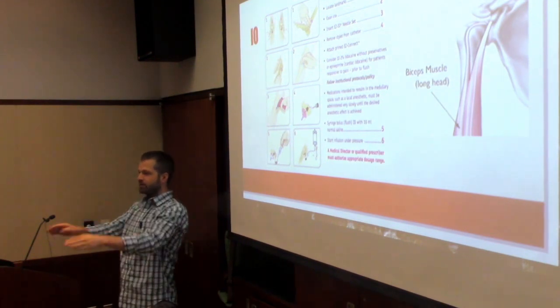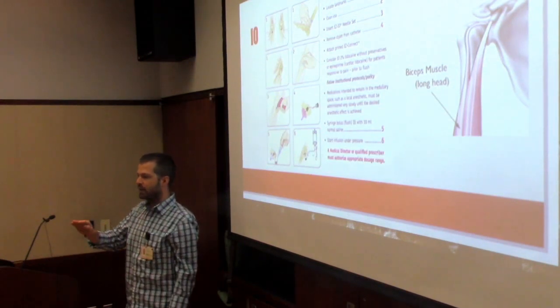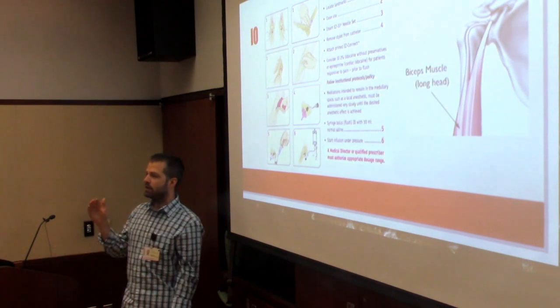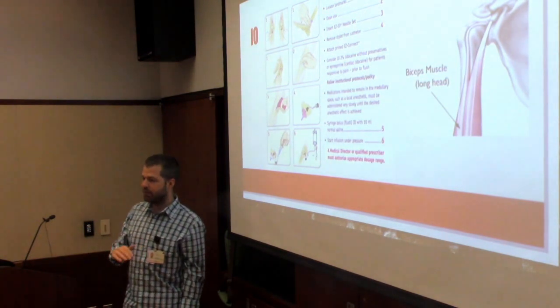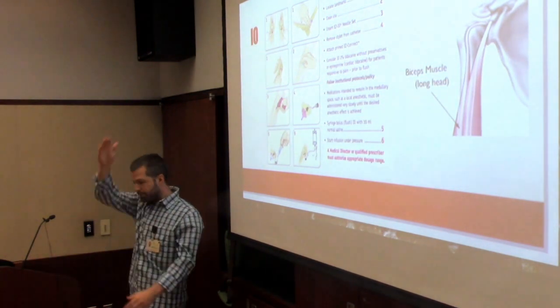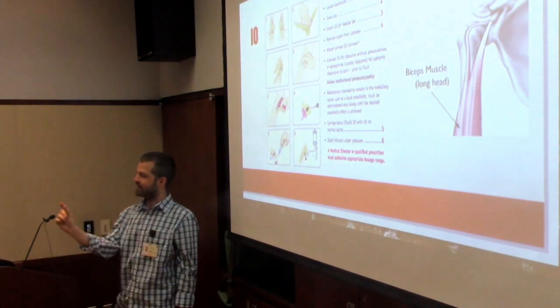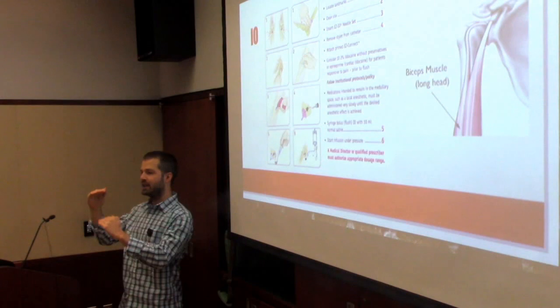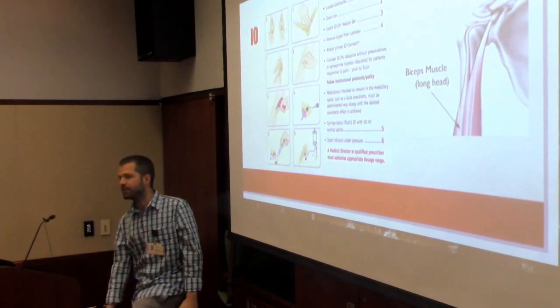Find the tip. It's like a triangle. So you find the top of the triangle. And if you can't remember if it's medial or lateral, check both sides. For most of us, when you feel the medial side of the tibia, there's a big flat surface. So for me, it's this thick. It's 1.5 inches, and it goes for about 6 inches. And it's a big, big flat platform.